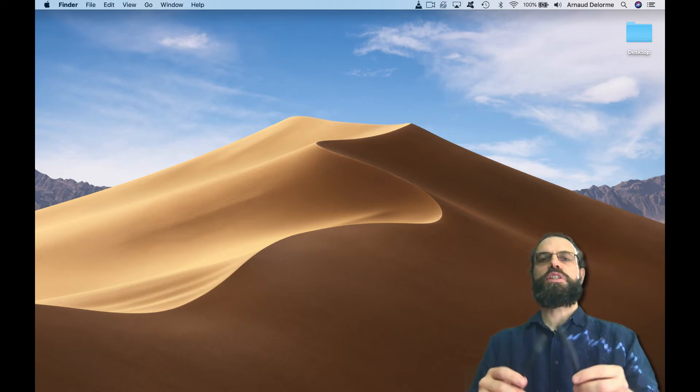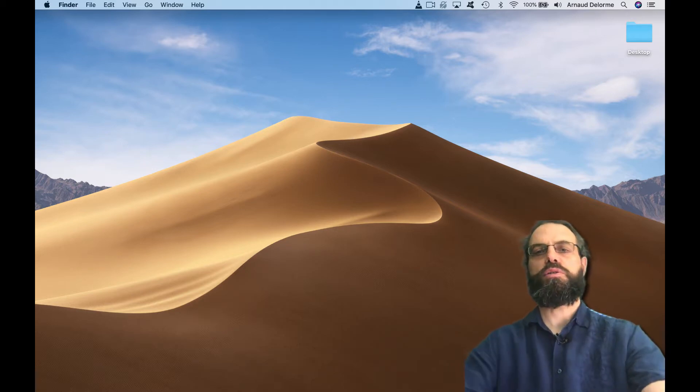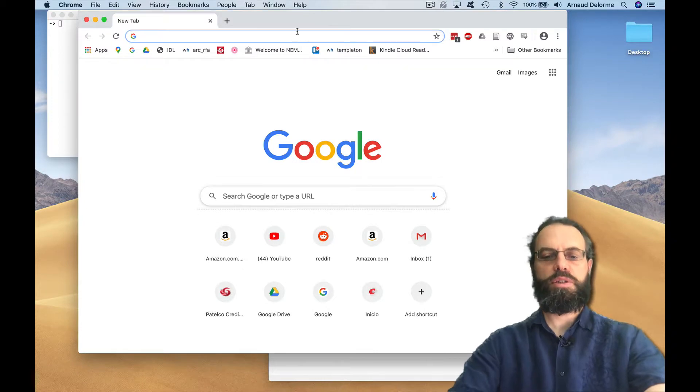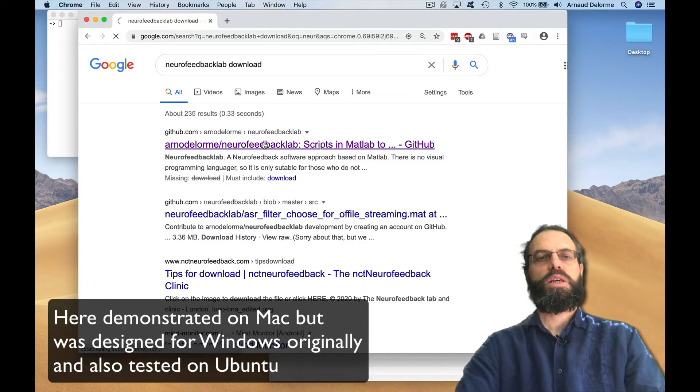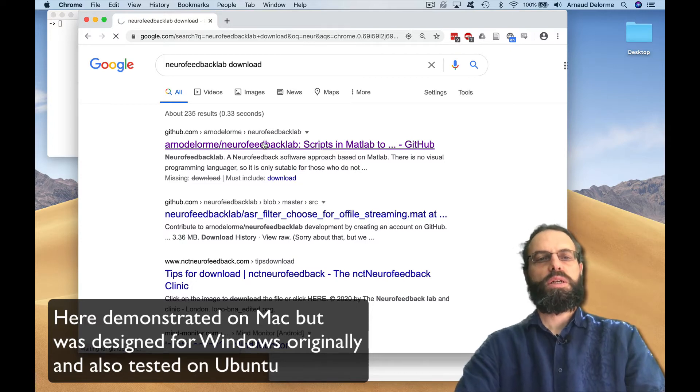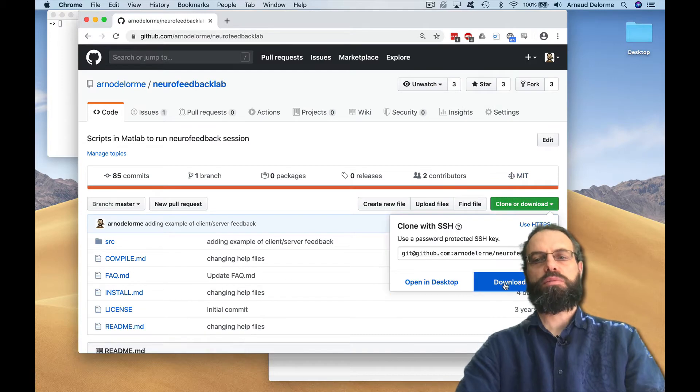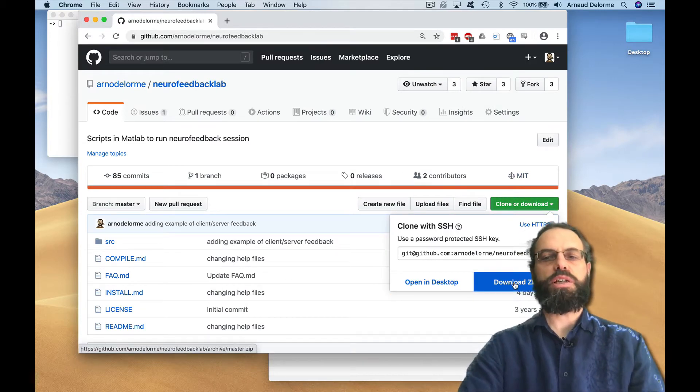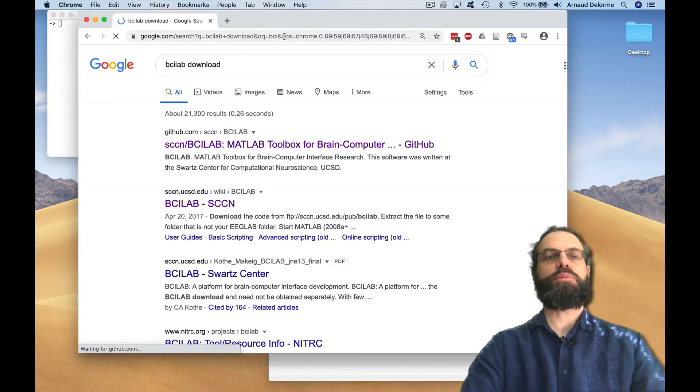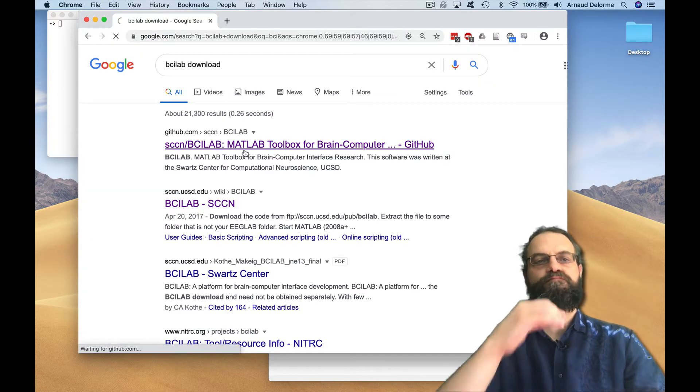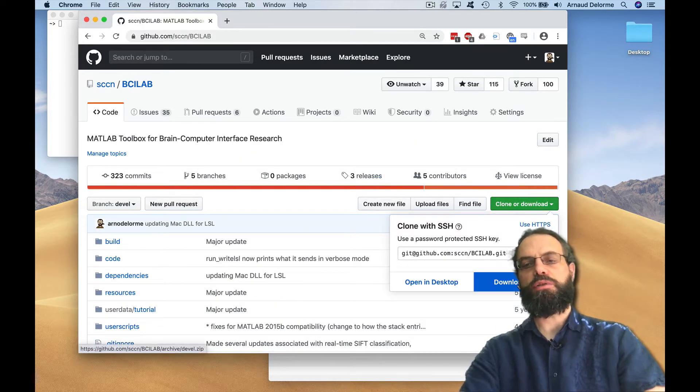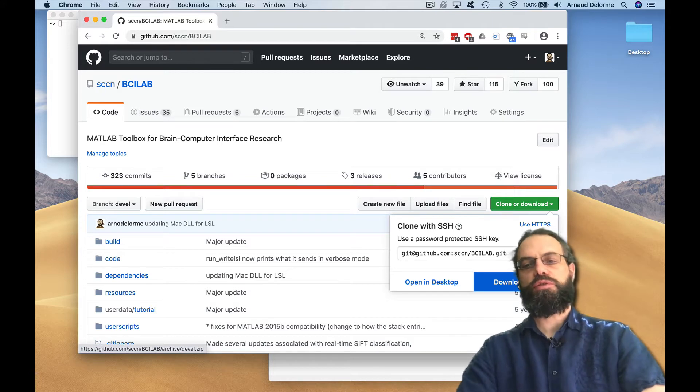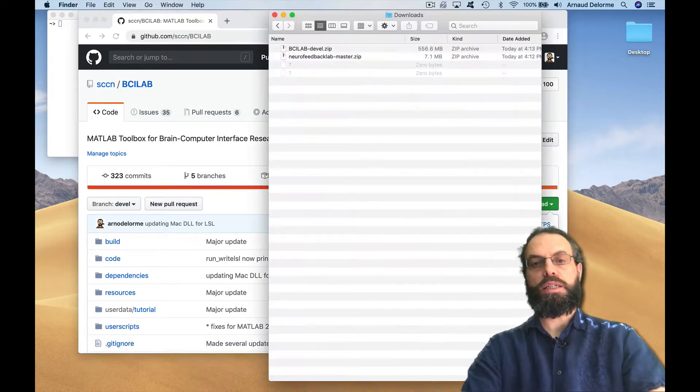First, we're going to download the program. Go on Google and type Neurofeedback Lab download. That's on GitHub, so download the zip. Then we need another one called BCI Labs, so type BCI Labs download, clone or download, and download the zip. This one is a bit bigger. Once you've downloaded these programs, what do we do?